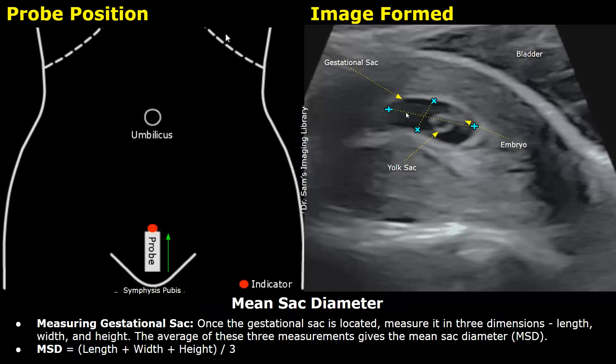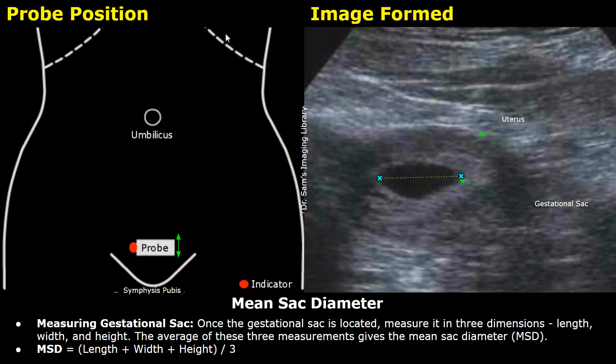Next, you can measure the mean sac diameter. Place one set of calipers across the length of the gestational sac and another set of calipers at the anterior and posterior aspects to measure the height. You will get the length and height in longitudinal view. For measuring the width, rotate the probe 90 degrees anticlockwise to view the uterus and gestational sac in a transverse plane, then place two calipers along the horizontal axis of the gestational sac to measure the width.